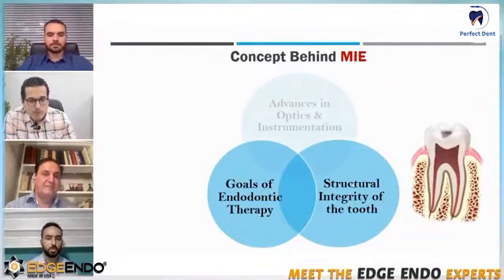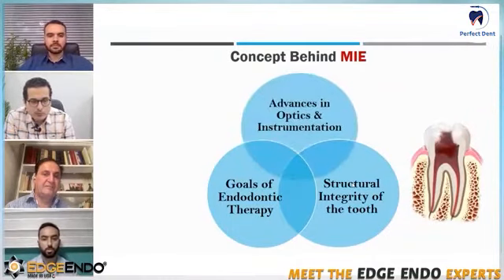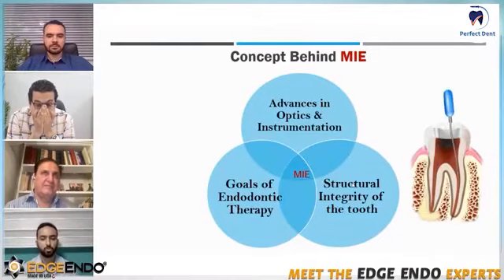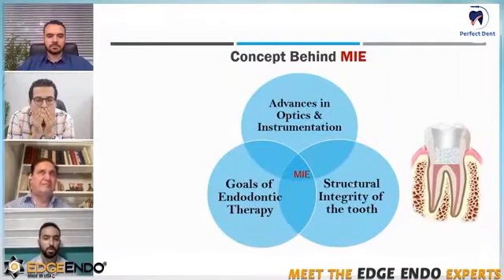And now, with the recent advances in optics and instrumentation, we can provide a minimal invasive approach. So basically, being minimally invasive is to provide a proper root canal treatment with the least amount of tooth structure to be lost, and that can't happen without proper armamentarium.